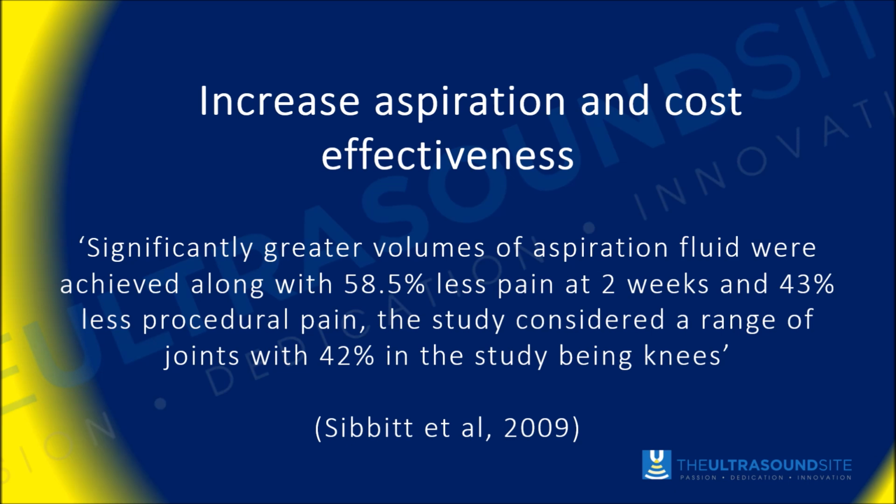If the capsule is closing down on the tip of the needle, or if we're against one of the folds of the capsule, we can move the needle tip. So that has certainly been demonstrated, that people can use these more technical aspects in their procedures when they're doing them ultrasound guided.